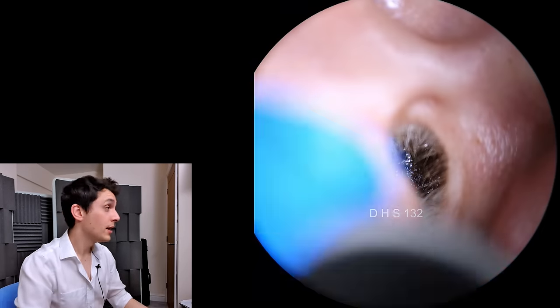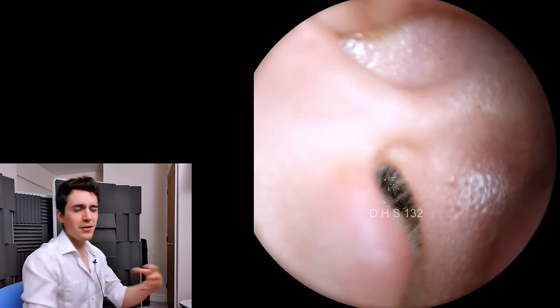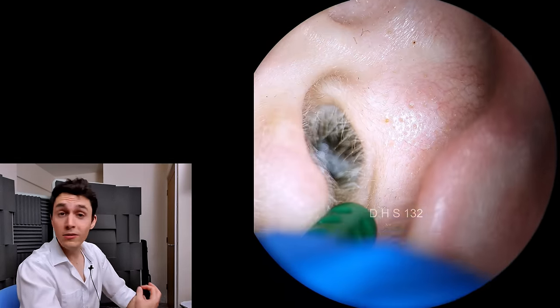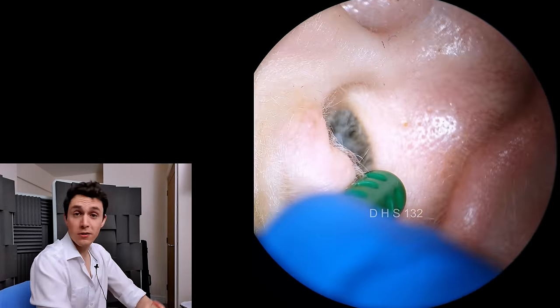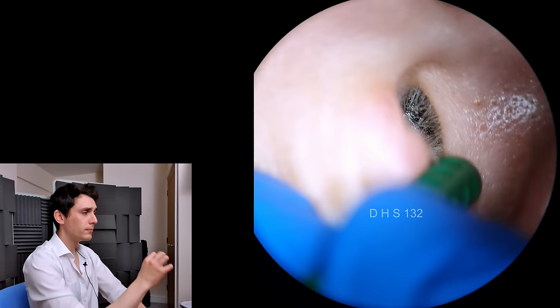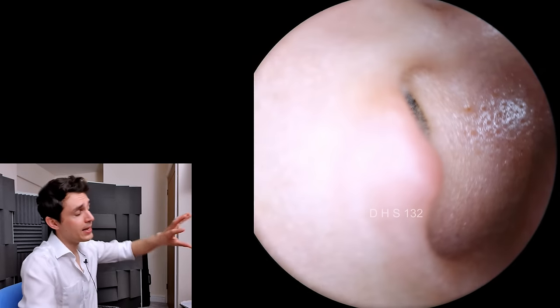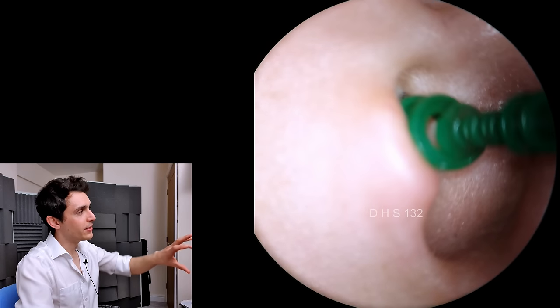It's a rather interesting, unusual looking thing. It's a proper certified medical device for use by audiologists and doctors and nurses. What it is, it sort of looks like a corkscrew basically, but it's a sort of open helix design.